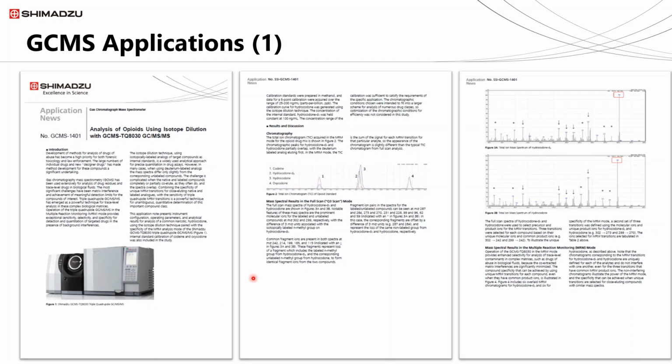This is one of the applications for GCMS. This particular application was developed on GCMS TQ8030 for the analysis of opioids using the isotope dilution method.